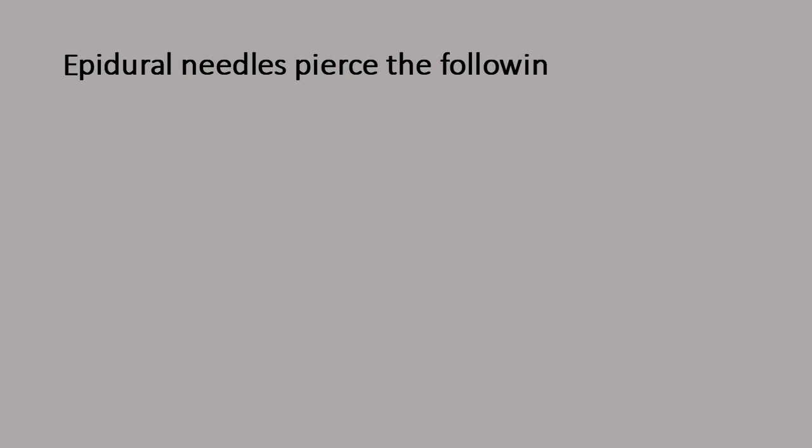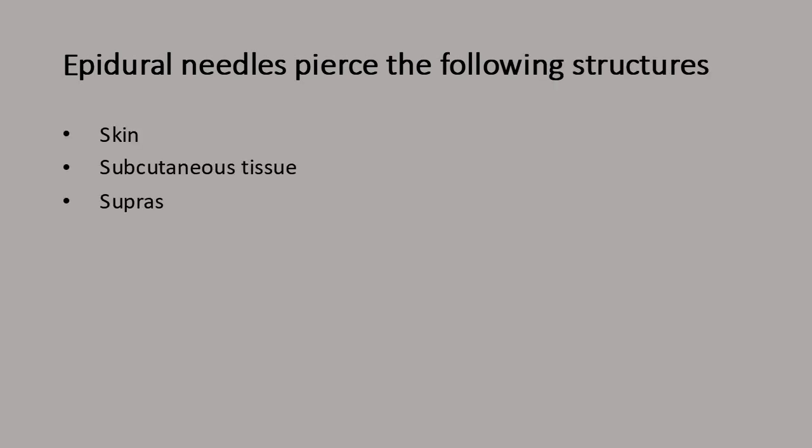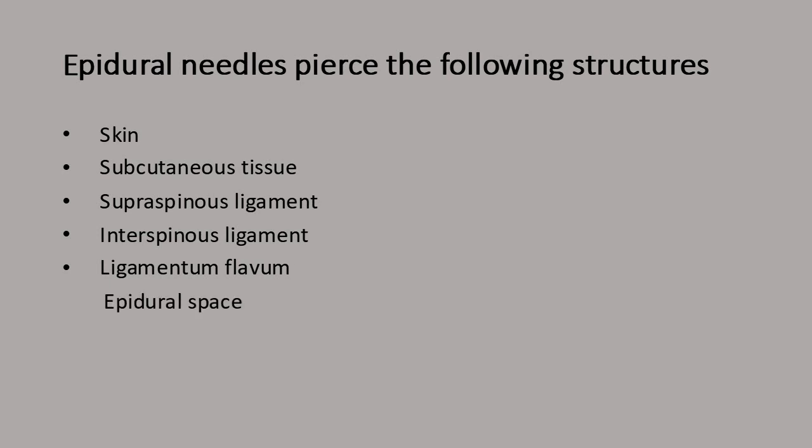Epidural needles pierce the following structures. Skin. Subcutaneous tissue. Supraspinous ligament. Interspinous ligament. Ligamentum flavum. Epidural space.